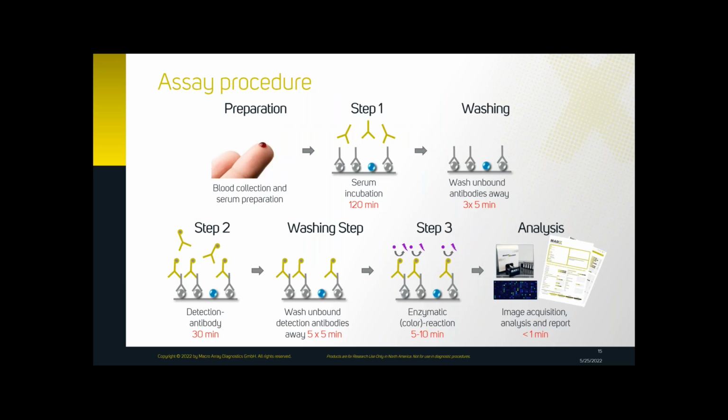So what is the manual assay procedure, or also the assay procedure that is then performed in the automate automatically? You prepare a small volume of serum or blood, and this is sufficient to detect the patient's sensitization status. In the first step, the particle-bound allergens react with the specific Ig that is present in the patient's sample. After the incubation, unspecific Ig is washed off.